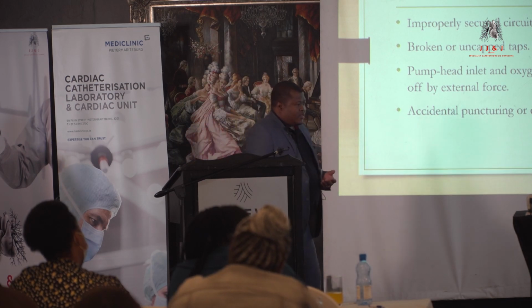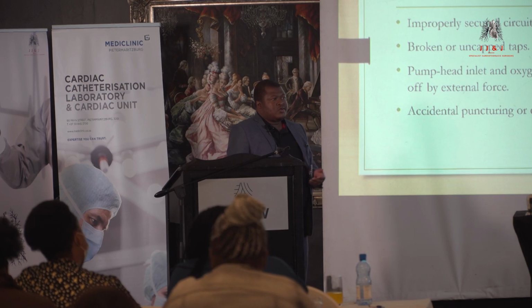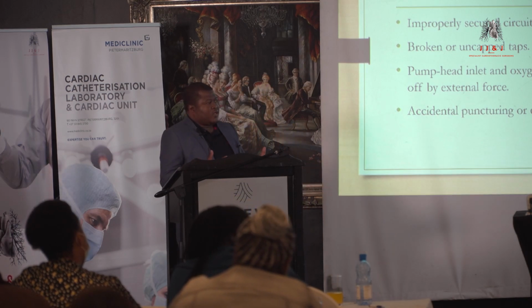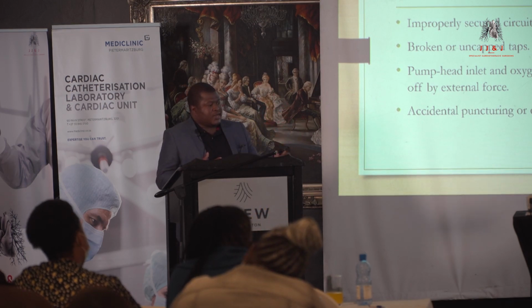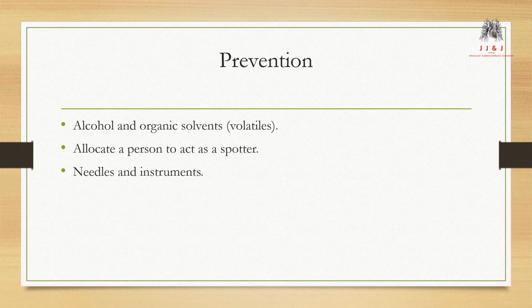So in ICU, sometimes you're going to use needles, you're going to use blades. So you must be very careful using those things close to the circuit, because you can puncture the tubing, you can cut the tubing. Next slide.